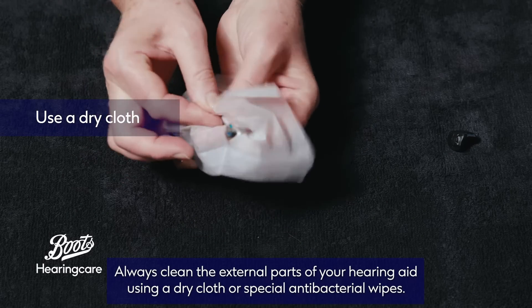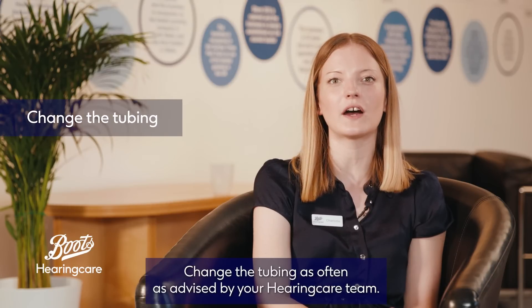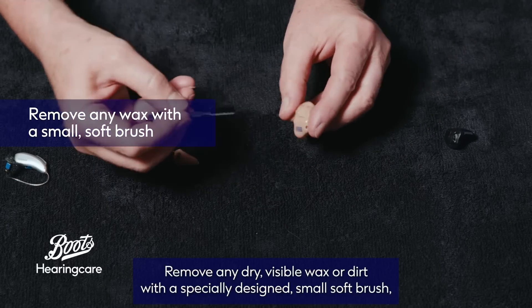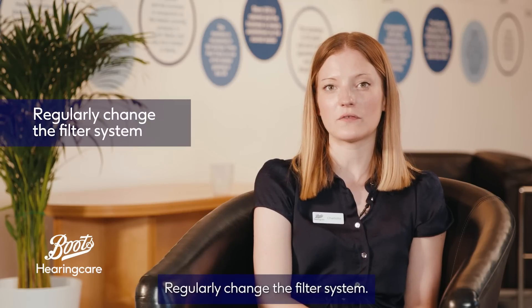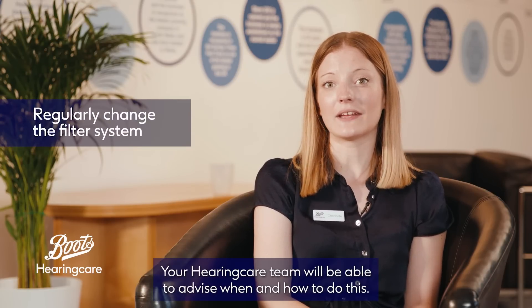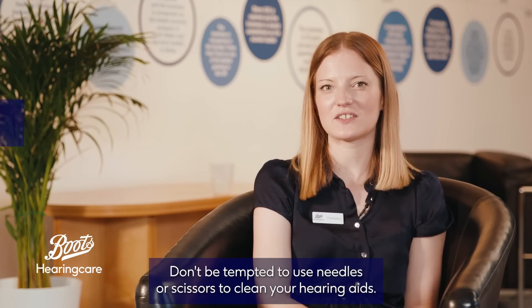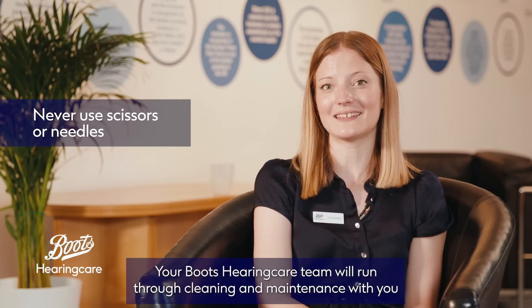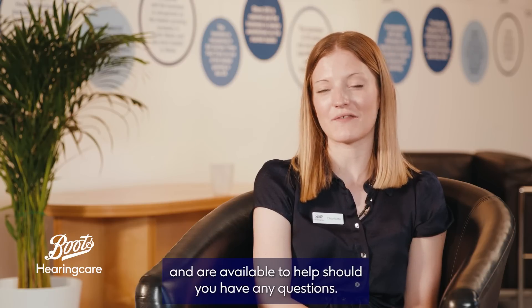Always clean the external parts of your hearing aid using a dry cloth or special antibacterial wipes. Change the tubing as often as advised by your hearing care team. Remove any dry visible wax or dirt with a specially designed small soft brush, which can be supplied from your hearing care team. Regularly change the filter system — your hearing care team will be able to advise when and how to do this. Don't be tempted to use needles or scissors to clean your hearing aids. Your Boots Hearing Care team will run through cleaning and maintenance with you and are available to help should you have any questions.